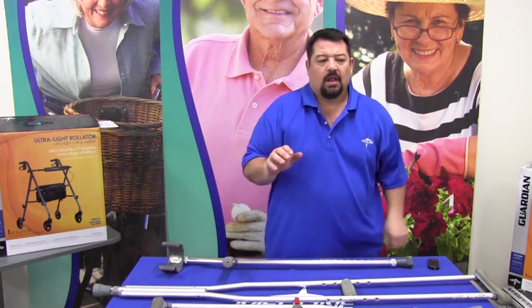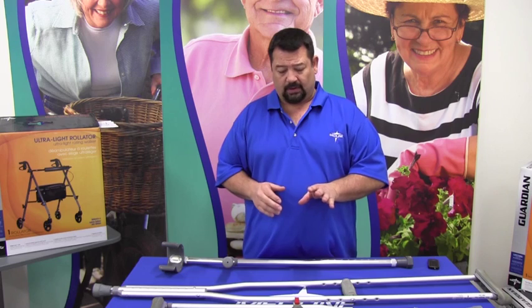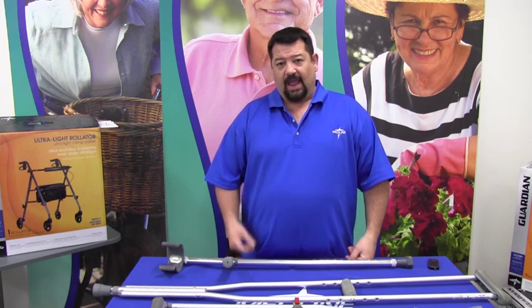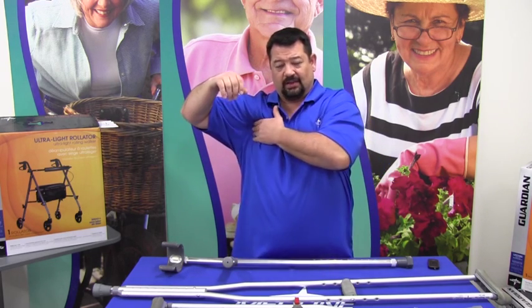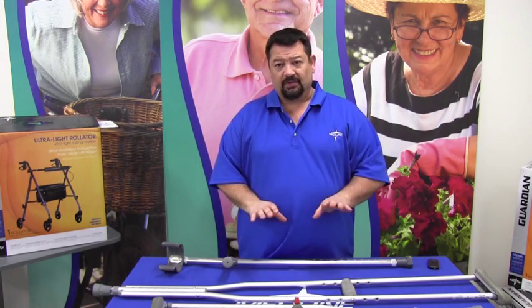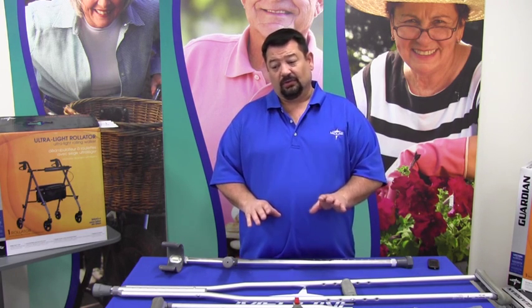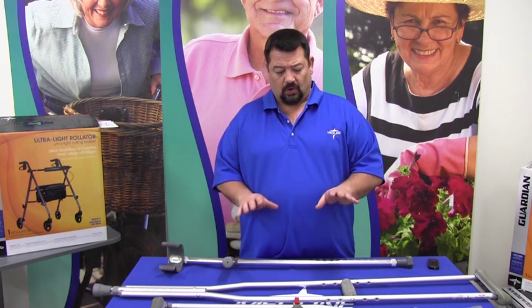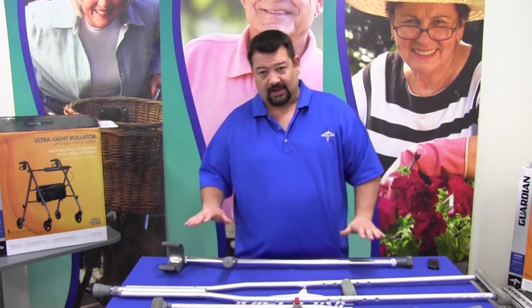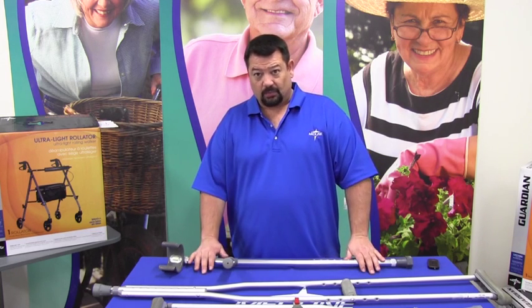The most common complaint you hear about crutches is that when you use them, they hurt your armpit. 90% of the time that's because the crutch itself isn't fit properly and they're leaning into it, which takes the tendons and the ends of the muscles and rubs on them, causing irritation. Properly sized crutches don't have nearly the discomfort, and as long as they're properly used, everything is kept to a minimum. So sizing is important. The sizing on an axillary crutch is slightly different than on a forearm crutch, and we're going to go through the forearm crutch first.